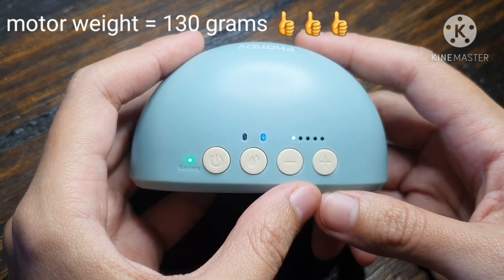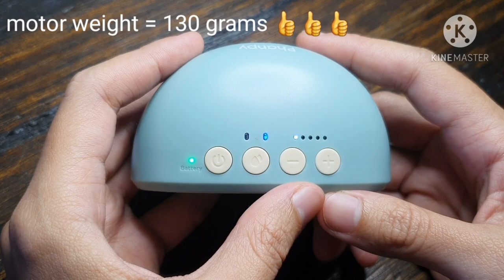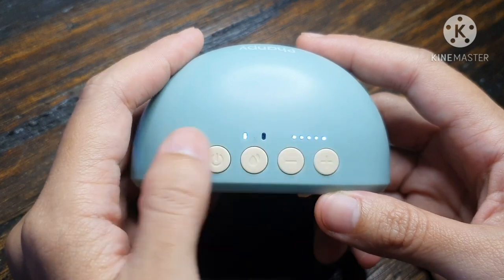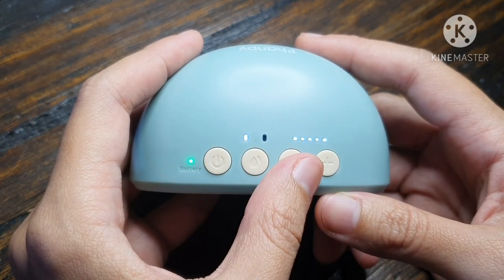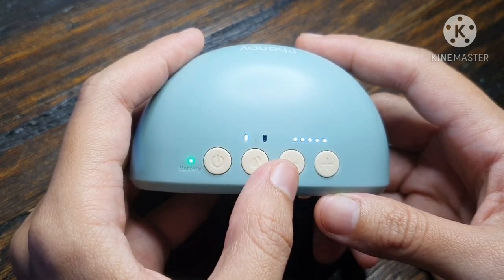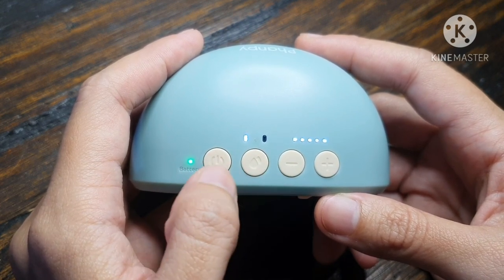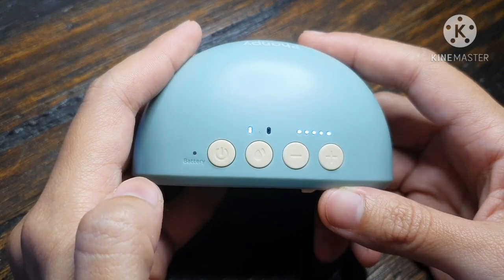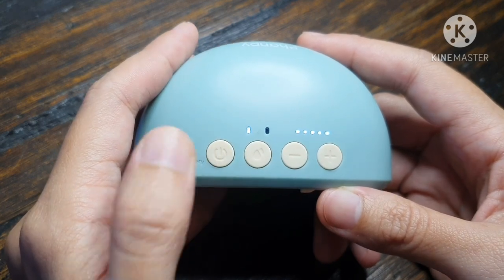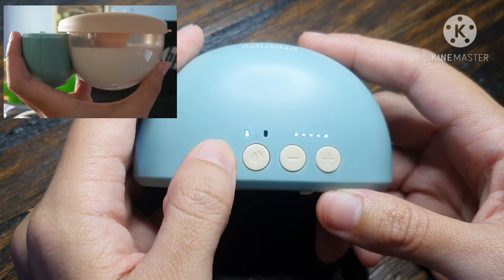Yung na-mention ko before — after 20 minutes, pag na-busy kayo, automatically mag-pause siya. Kapag wala kang na-press na button dito, after 5 minutes naman, automatically mag-turn off siya. Kapag may pinindot naman kayo after niya mag-pause, continue lang siya. Ang kinaganda nito, may pause button siya. Ang pause button, press niyo lang itong on and off button — mabilisan lang na pag-press, kasi pag 2 seconds, automatic mag-off and on siya.